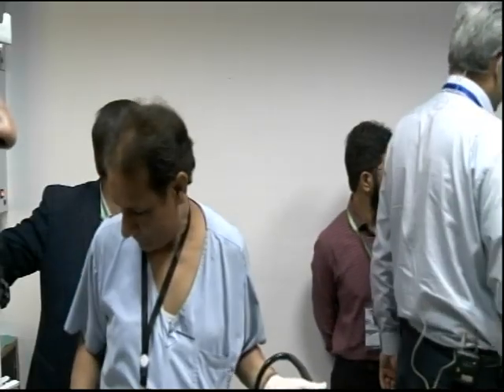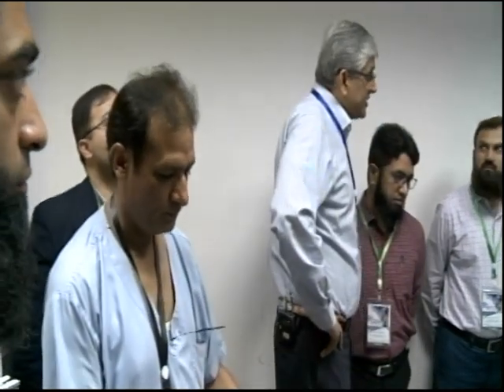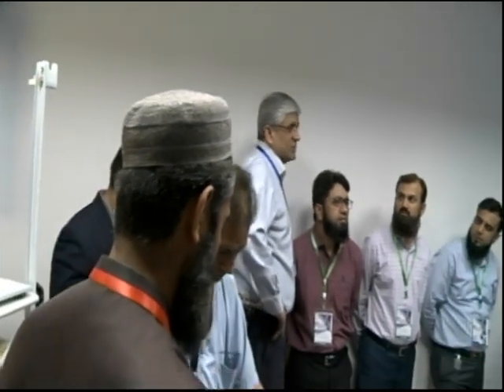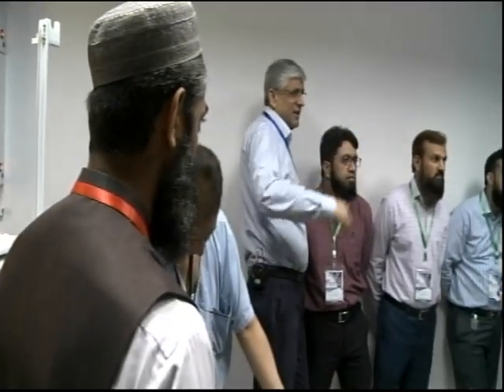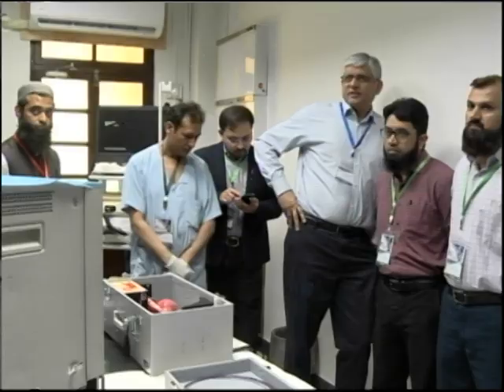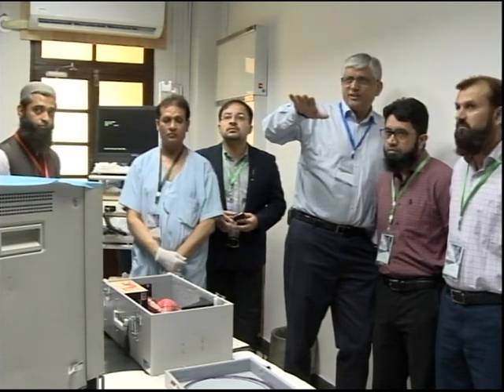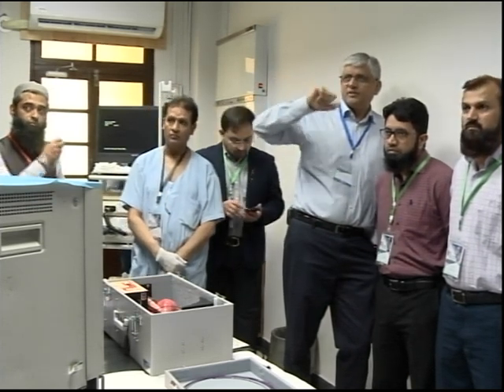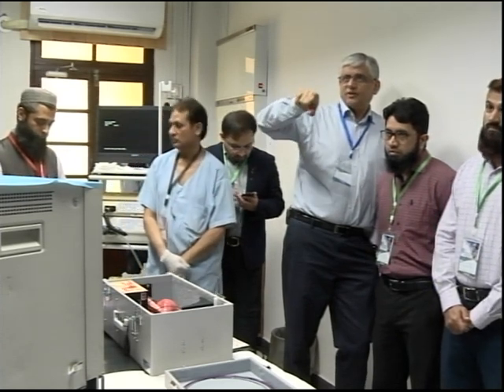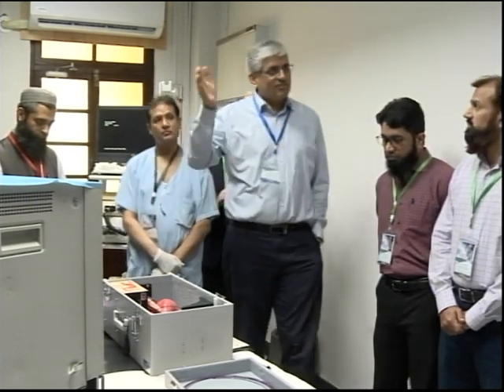So what should be the ERCP success rate for an individual to be independent in ERCP? What should be his success rate for an individual to be independent ERCPs, according to, if I'm not wrong, US, it's 150? Success rate over 90%. No, but when you're allowed to do independently, it's 150 the number? You've done 150? 300 competence, UK got 200. So you should have done 200 or you should have done 300.